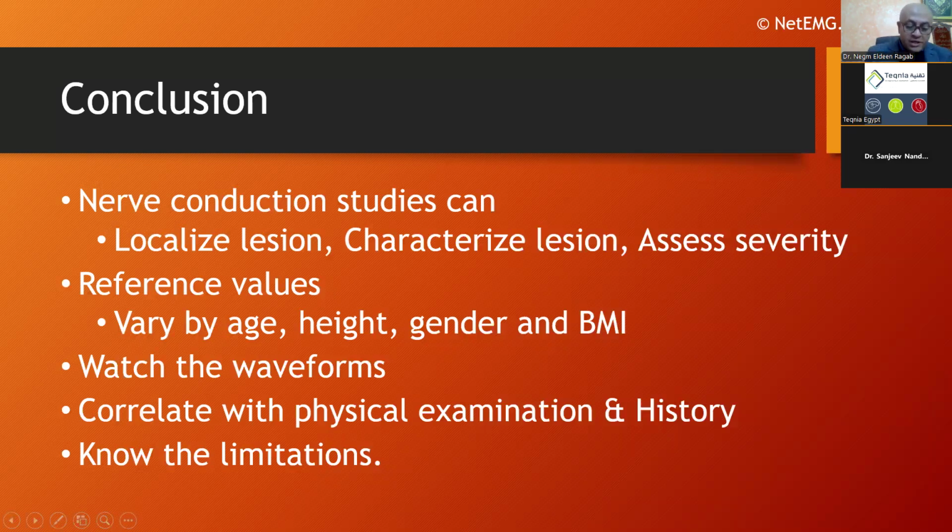My second question is about the sensory nerve action potential in differentiating localization of radiculopathies from plexopathies. In some cases of radiculopathies, especially L5 or S1 root affection, we can find an abnormal SNAP. How can you explain this?